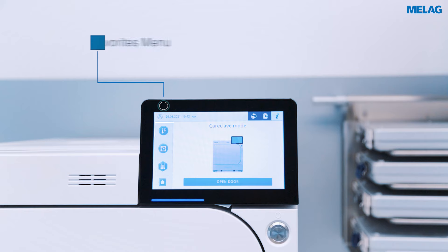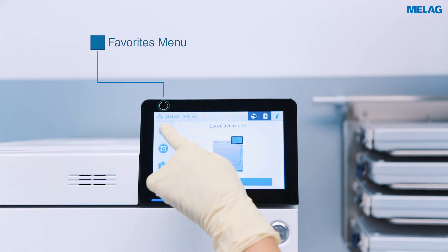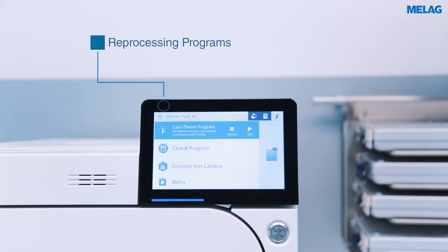For time-saving operation, Careclave offers quick access to the most important menu items. The favourites menu on the left side of the screen contains predefined reprocessing programmes, service programmes, and the main menu.